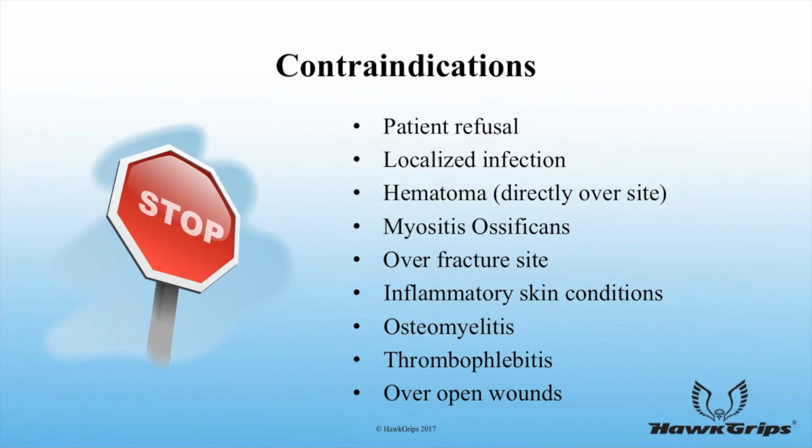There are also a few contraindications to consider, such as patient refusal, localized infection, myositis ossificans, treatment over a fracture site, inflammatory skin disorders, osteomyelitis, thrombophlebitis, and over an open wound.